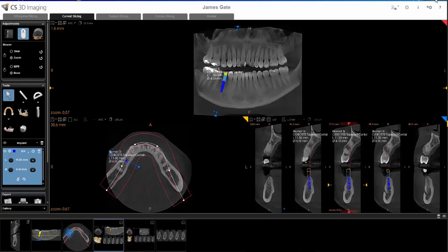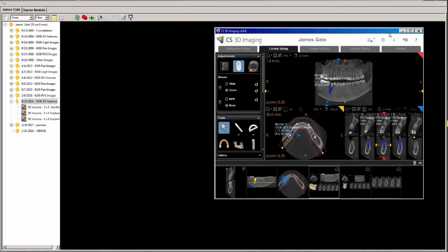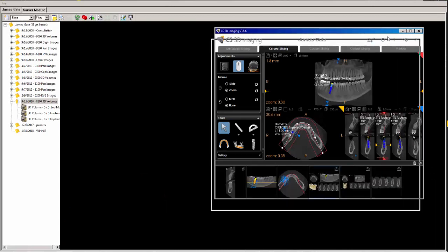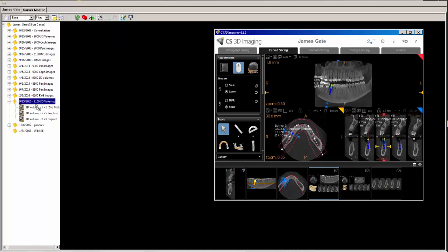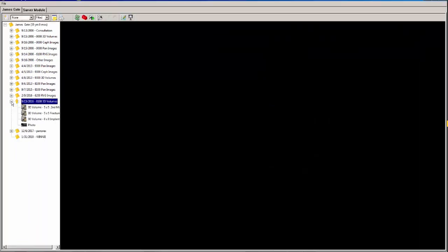If you reduce the size of the 3D software screen, you'll notice that the 2D software is open behind it. If you left-click and drag a screenshot from the gallery over the exam folder and let go, the screenshot will be dropped right into that folder.